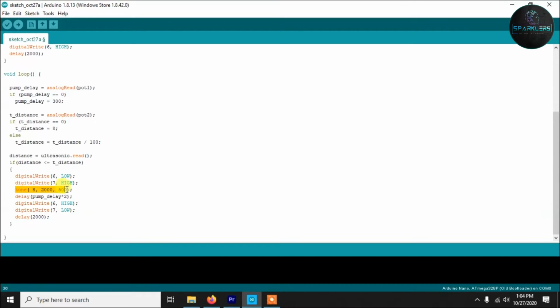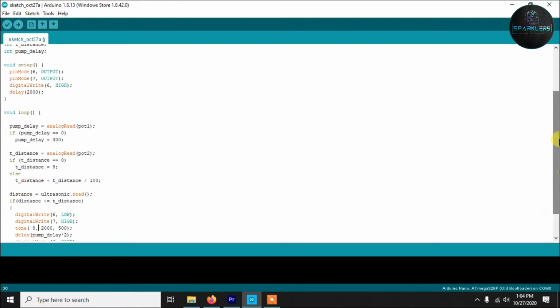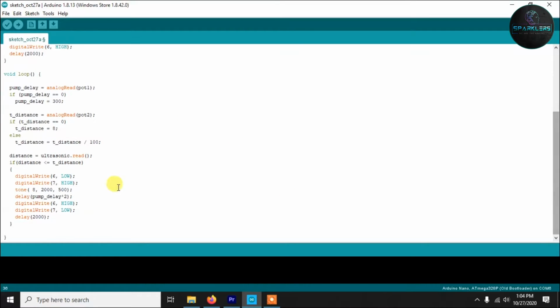For that we have used this tone method. In tone we have passed pin number 8, because pin number 8 is the piezo pin. So you can also write piezo pin here. I have written pin number 8, but you can write that. And there are these two values. This is just to make a beep sound. And then finally we are giving a delay. So these two things will only happen for this amount of time. The pump will be turned on and the LED will be turned on, then it will wait for this amount of time, and then the pump will be turned off and the LED will be turned off.